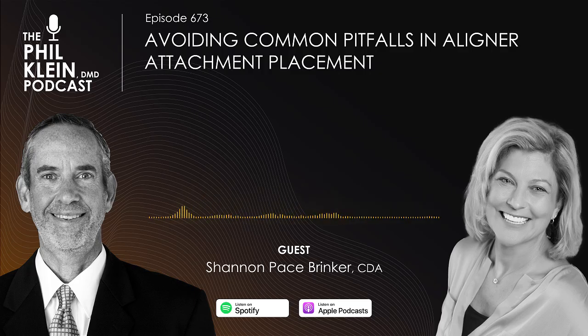So there's no question that there's a huge emergence of dentists that are using aligner therapy. It's getting more and more popular. The success rate of aligner therapy has been fantastic. There's software that helps dentists do these procedures, and the presence of attachments significantly improves aligner retention and also orthodontic tooth movement. And we all know that it's made a major impact on the way we move teeth. So to begin this episode, tell us why the attachment is so important. And this, of course, relates to the importance of the template itself.